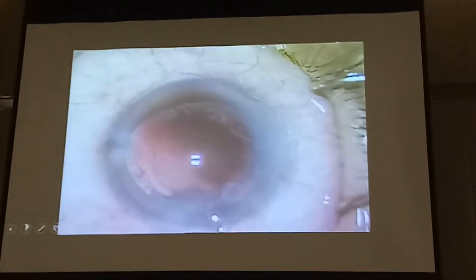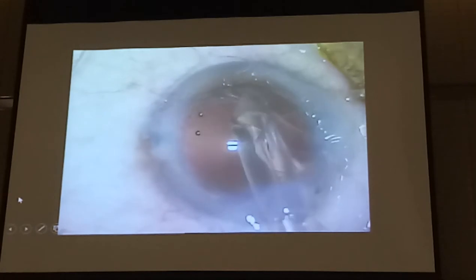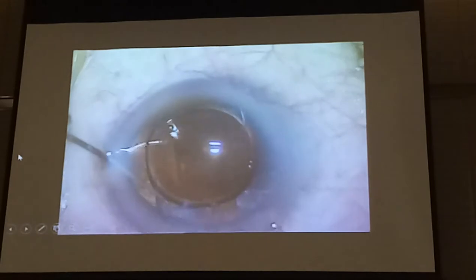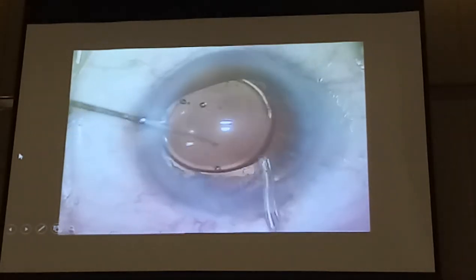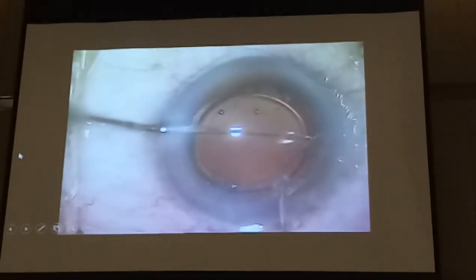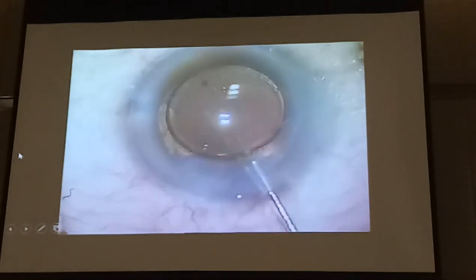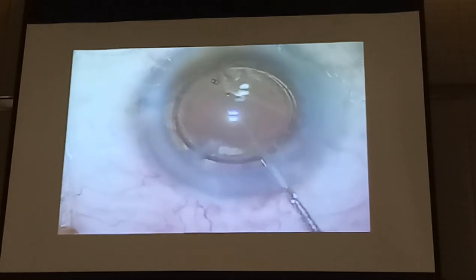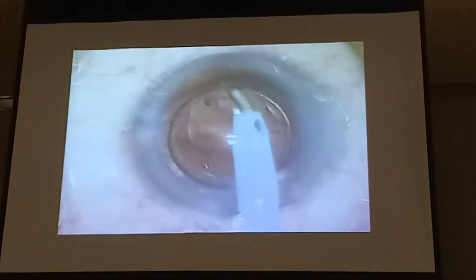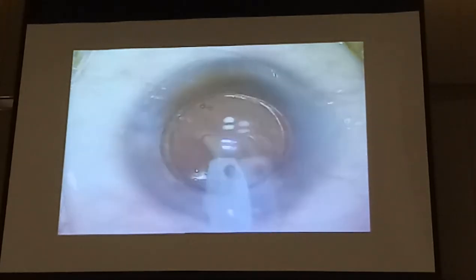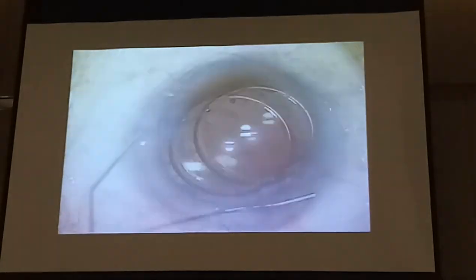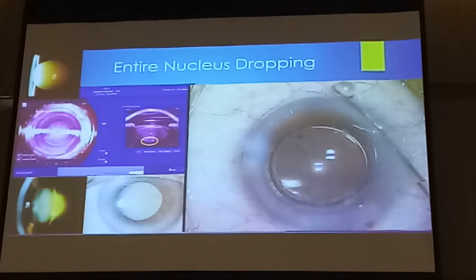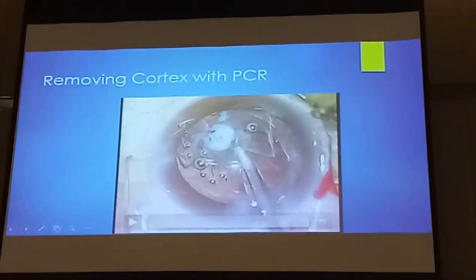I don't face my phaco tip forward — if anything, it goes backwards so that I don't push all the energy to the corneal endothelium. You see no vitreous loss. It was early recognition, and then I can manage it so I don't have vitreous loss. Then I can do this nice optic capture because it has perfect reflex, it's well-centered. Then you can just reverse the order — take out the cortex, but don't engage vitreous. So you can manage even with the entire nucleus in the anterior chamber.